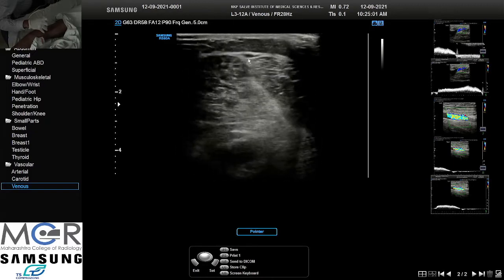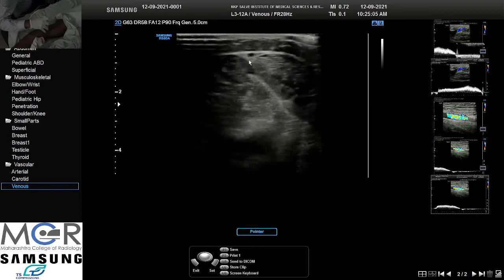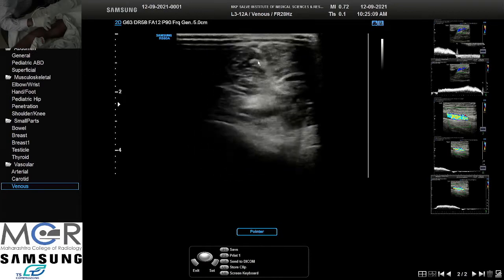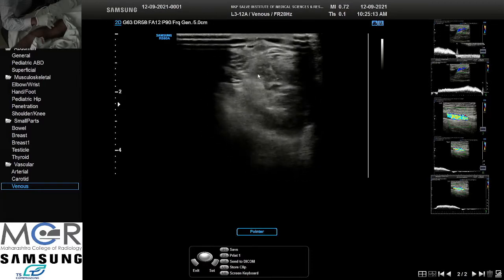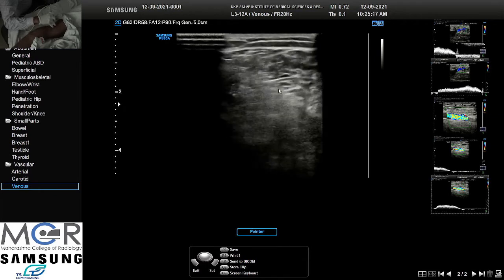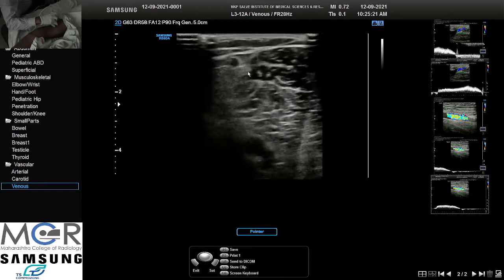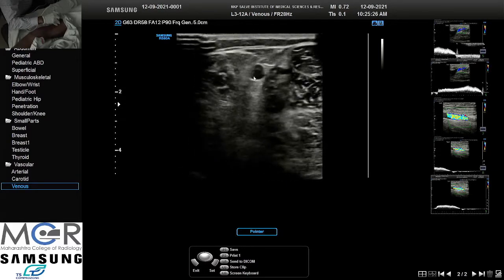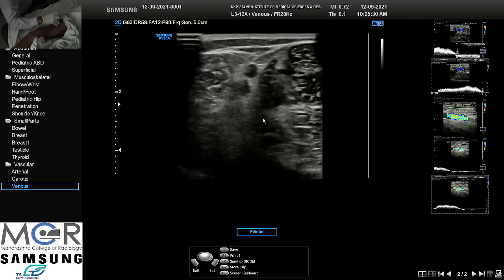That is the short saphenous here. These are the heads of gastrocnemius. That is superficial fascia, and this is the short saphenous. Again, like GSV, it is in the fascia. You can see that. Now it is dipping down to go enter into the popliteal vein.